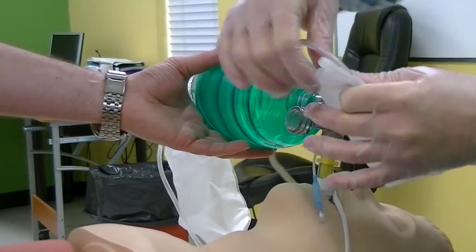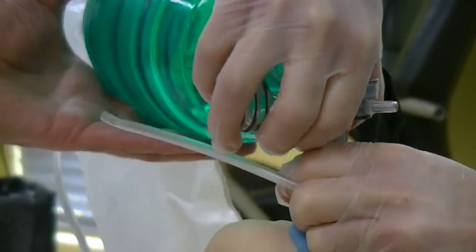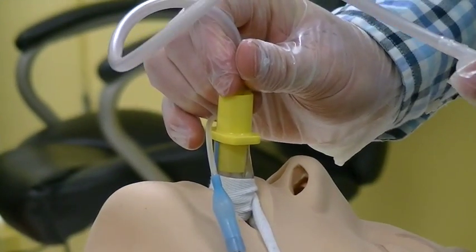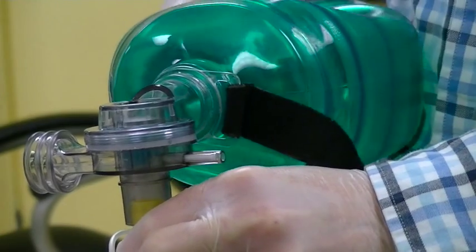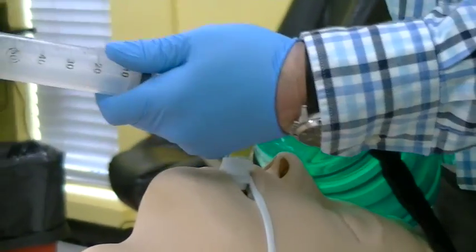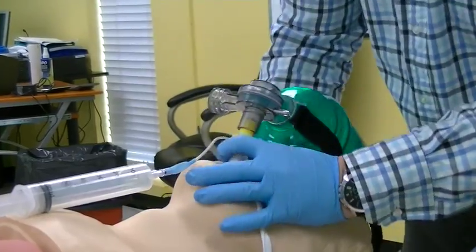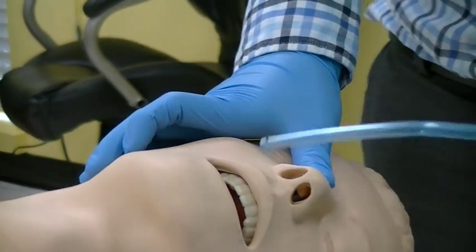Hyperoxygenate your patient with 100% oxygen and prepare the suction catheter. To apply suction, cover the open port with a finger. Insert the suction catheter and apply suction. Attach your BVM and continue ventilation. To remove the King LT, deflate the cuff. Remove the tube tie and roll the patient to their side. Remove the King LT and suction the oropharynx as required.